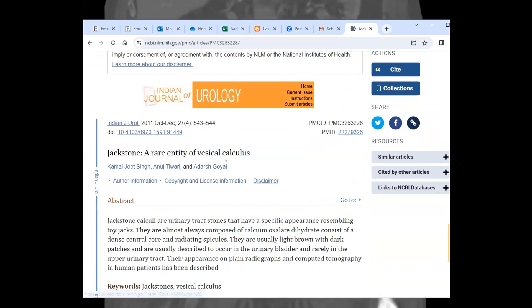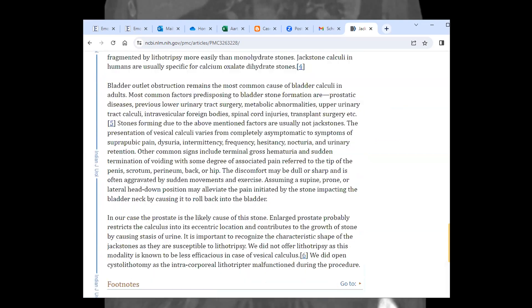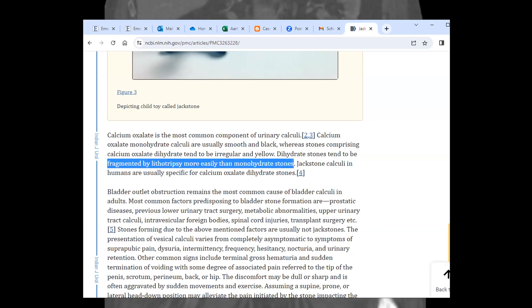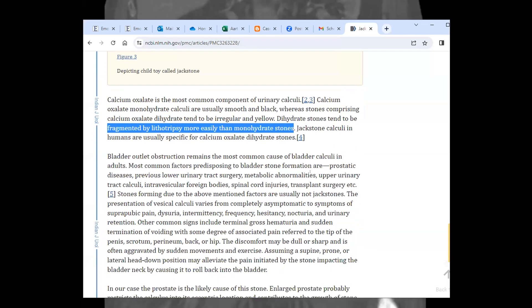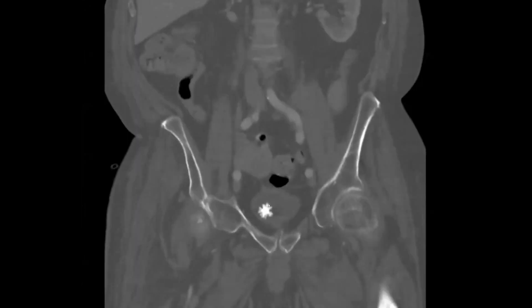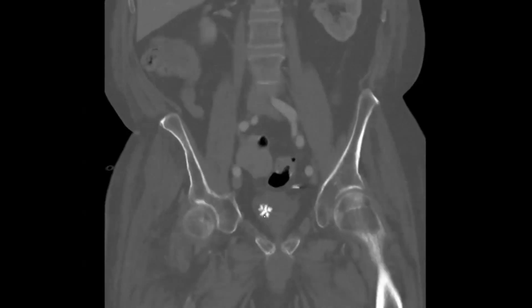This article is about the rare entity of vesical calculus — courtesy of my fellow Odessa. It's made of calcium oxalate dihydrate, which is specifically why it makes these kinds of radiating spicules — the way this molecule forms is through these spicules. It's a primary bladder stone, and importantly, dihydrate stones can be fragmented by lithotripsy more easily than monohydrate stones. These jackstones can be broken up by lithotripsy and removed piecemeal through the bladder.